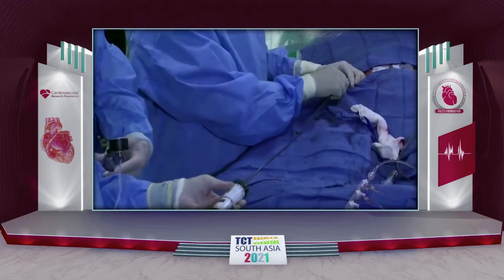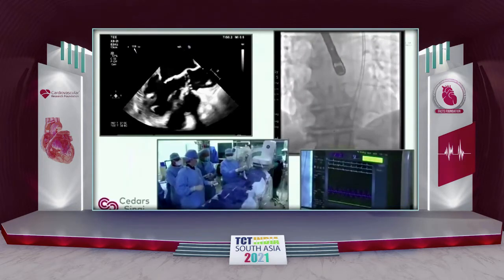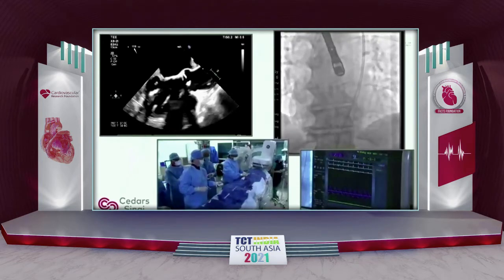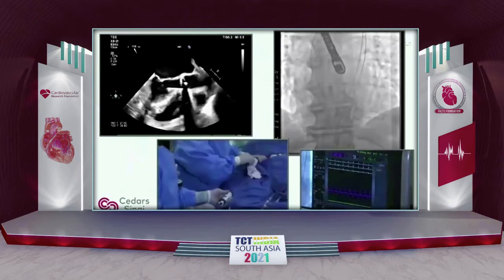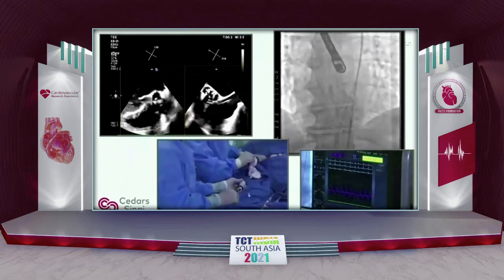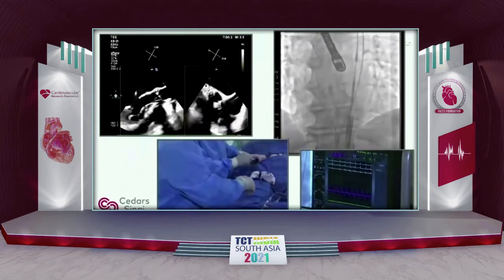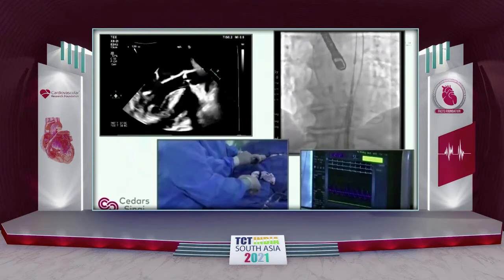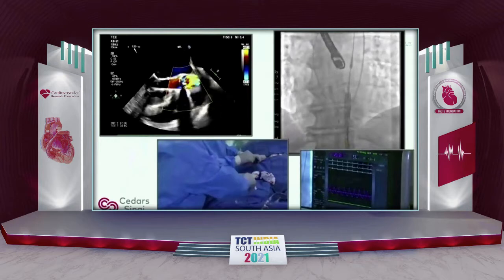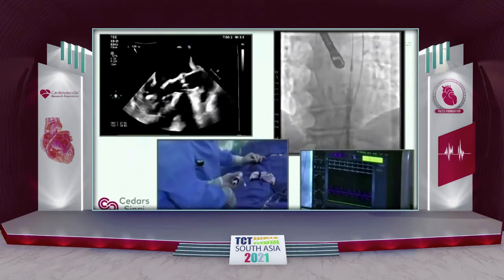Dwayne, what's your practice? Yeah, we're infrequently pre-dilating, as Saurabh said, but the lesion sets or the patient sets that we do pre-dilate in is bicuspid valves, especially with heavily calcified raphe. I find that when there's under expansion, particularly with the self-expanding valve, I'm worried about a pop out. And I don't want to aggressively deploy in a bicuspid valve with the Sapien. And so that's one set.